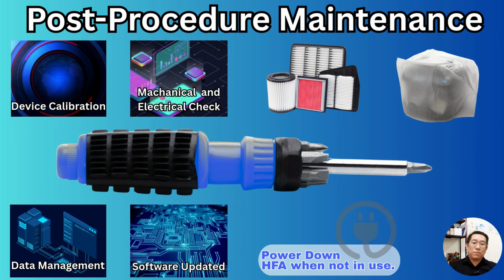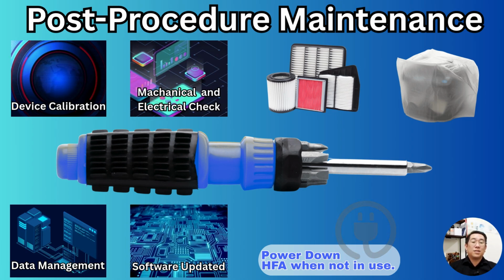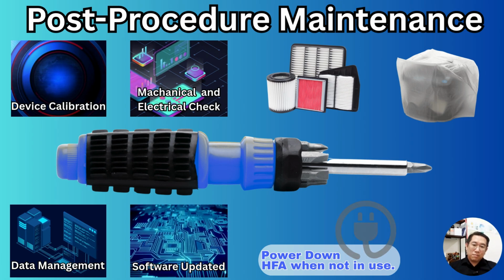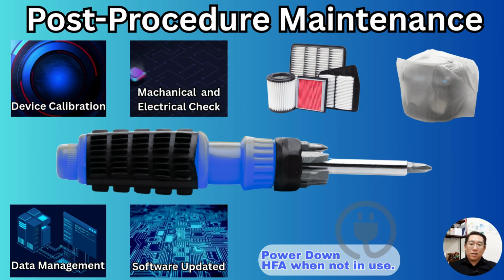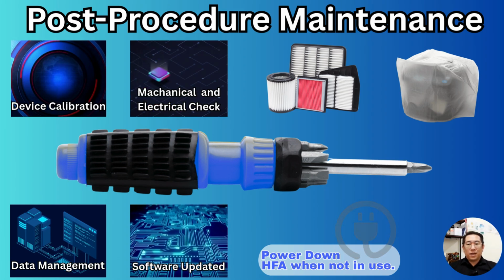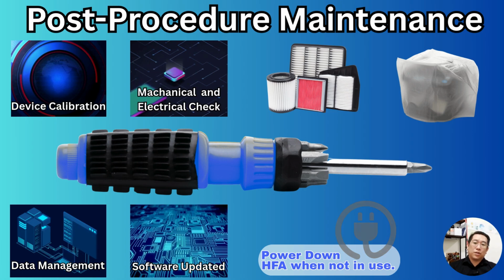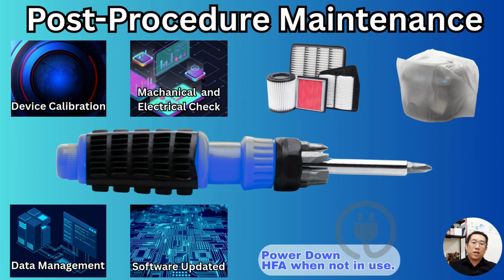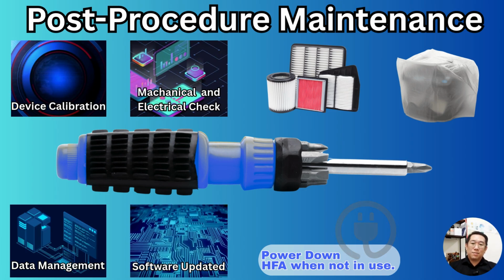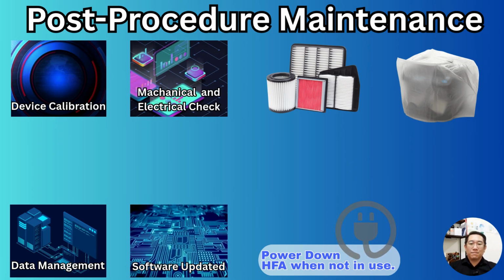Software updates from the manufacturer should be installed regularly to maintain accuracy and stability. Finally, at the end of the day, the device should be shut down properly and the bowl area covered with a dust cover to protect the optics overnight. If any issue arises that cannot be solved through basic troubleshooting, we should contact the technical support personnel to carry out servicing or repairs. Following these steps keeps the instrument accurate, reliable, and ready for long-term use.